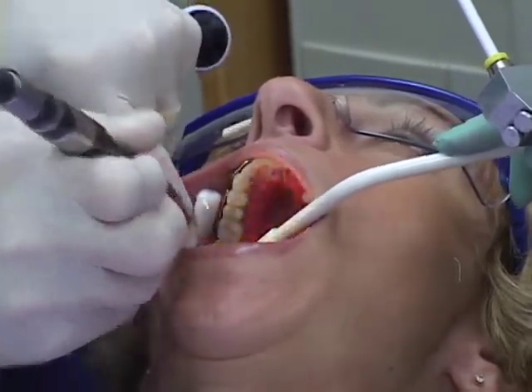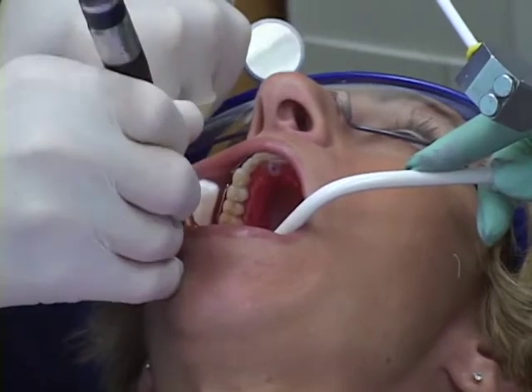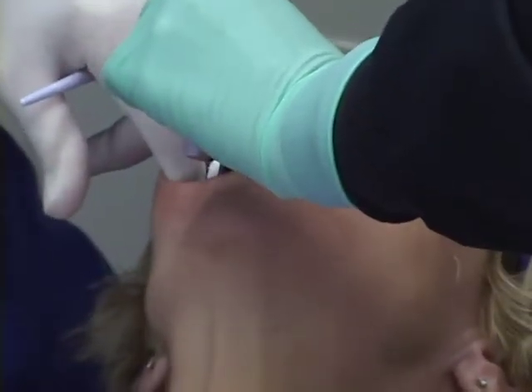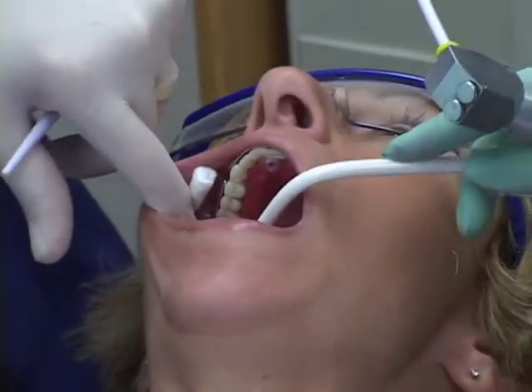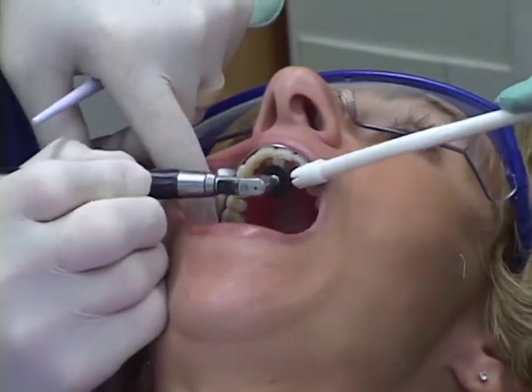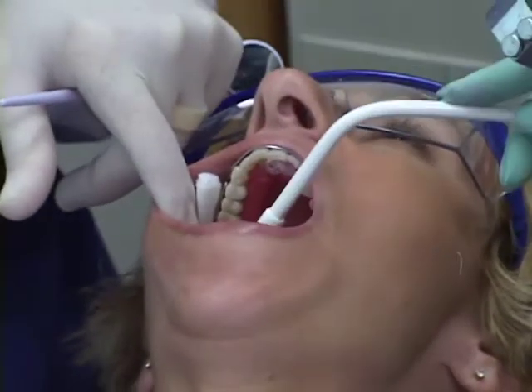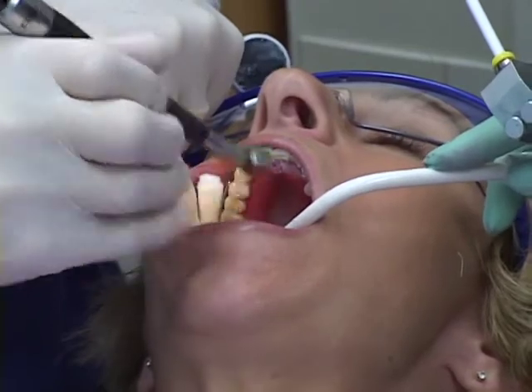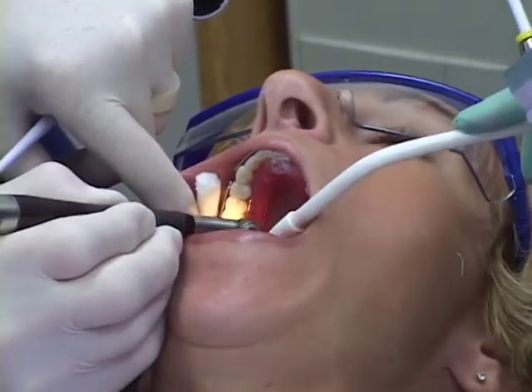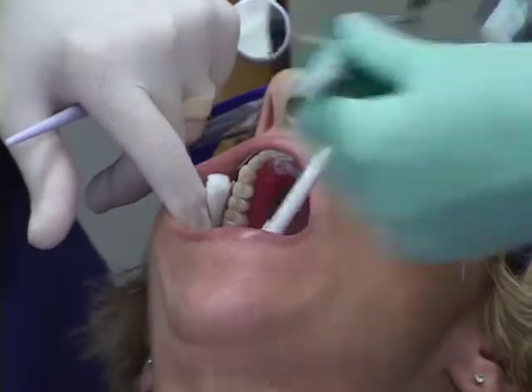Whenever I use the term reshaping of the tooth, it's not like I'm reducing a tooth, it's a reshaping process. I always want to adjust inclines typically, and also the facial and lingual surfaces. I also want to ultimately affect the position of the contact in such a way as to maximize axially directed forces on the teeth. Go ahead and tap, tap, tap, tap. Okay. Good. I don't know if you can see this, but I have not yet touched the cusp tip. It's strictly on incline, strictly adjusting, reshaping, recontouring the incline.